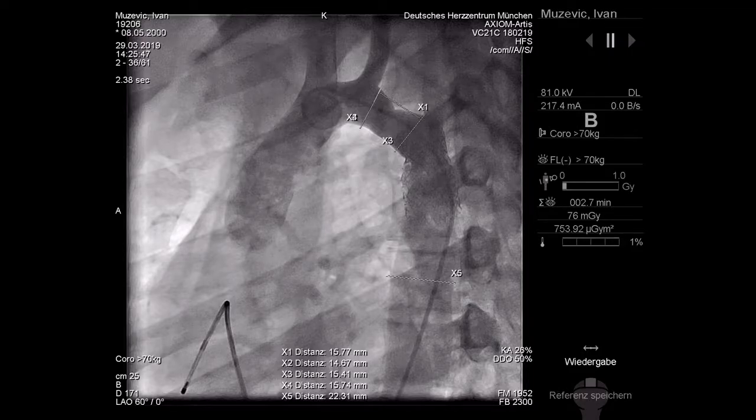And we want to implant a short 16 millimeter Max LD in this, with a 16 millimeter balloon. So the stent will, in the end, hopefully be as long as its diameter is. And we want to place it, hopefully, exactly between these two vessels, the carotid and the subclavian artery. And therefore, we decided to do it under rapid pacing. Any questions so far?